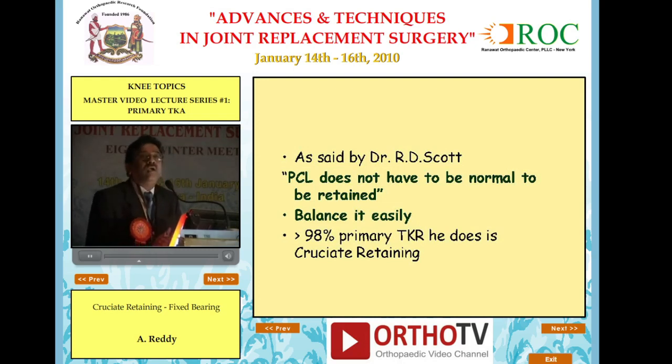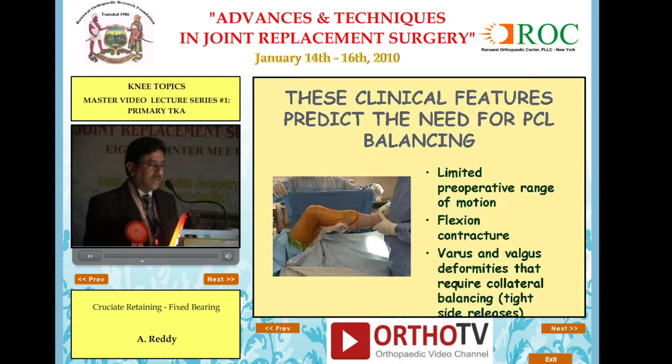Another important point which people say against cruciate preserving knees is they say the PCL is almost non-functional. But this is a statement given by Dick Scott: PCL does not have to be normal to be retained. So basically 98% of the primary TKR he does cruciate retaining, so do I. Most of the time it needs slight balancing.